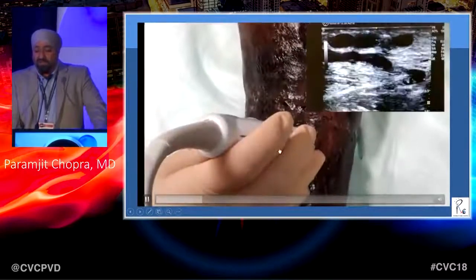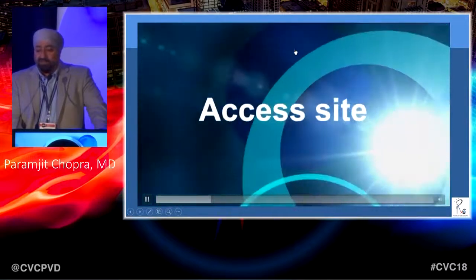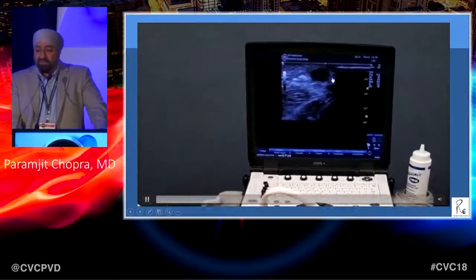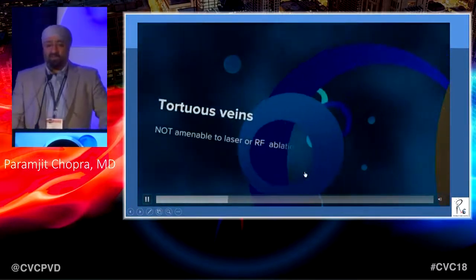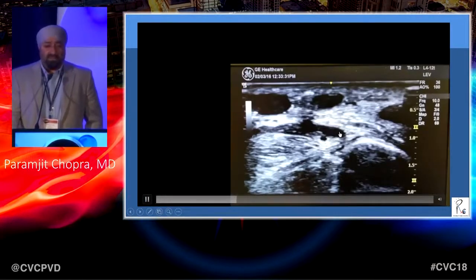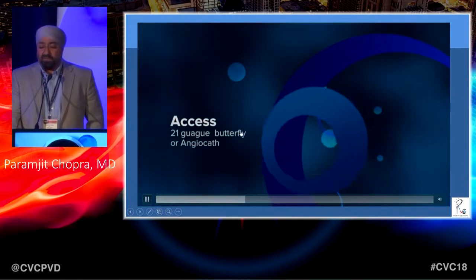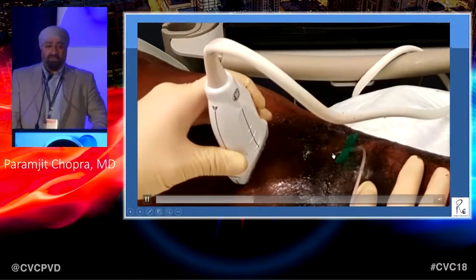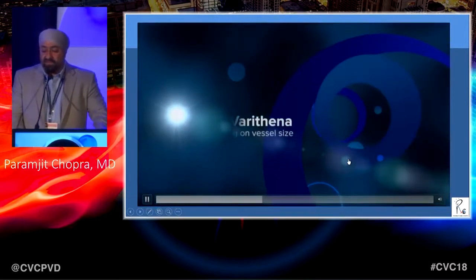So when I do the ultrasound underneath, you see there are these large vessels. And obviously there's a perforator filling that as well. And again, sterile, clean, needle in there. Pick this side, I can see that vein's fairly large right there. This is not amenable to laser or RF in any way for thermal. In the past, when we didn't have Varithena, we used kind of physician compounded foam, not a problem. So now we've got a 21 gauge butterfly. Sometimes if it's a straight segment, I'll put an angiocath in. But here the skin is hard, and I don't want to take that chance of pushing something in. But you can see there's the butterfly, secured it.